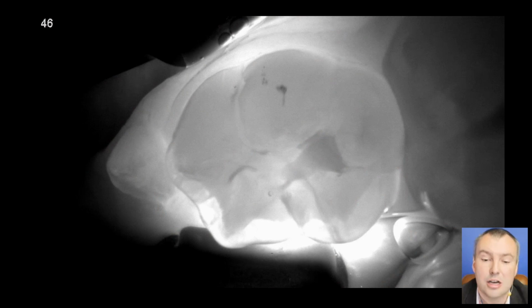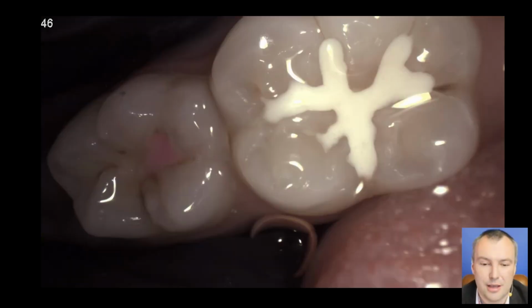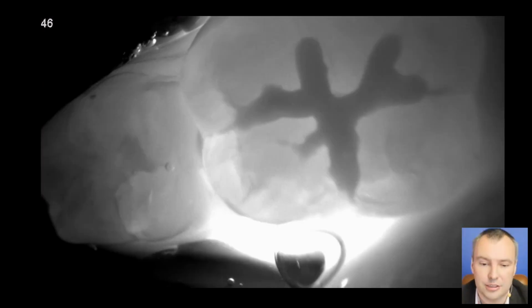We can observe also fillings from different materials, which will look different in transillumination mode, or in laser mode, so to say. And we can observe, like in this case, fissure sealants and some materials, for instance, glass ionomer cements or all metallic materials, which are not transparent for transillumination. So we won't see what's beneath such a material, but we can check the boundaries of the material and dental tissue. Are they clean? And is the quality of the fissure sealant in this case good or not?